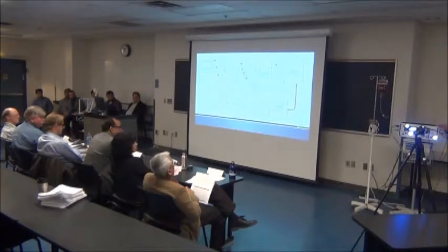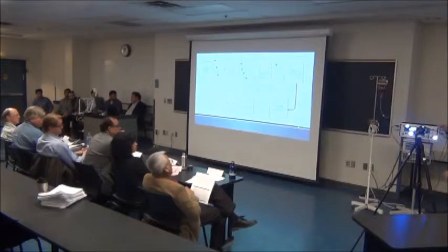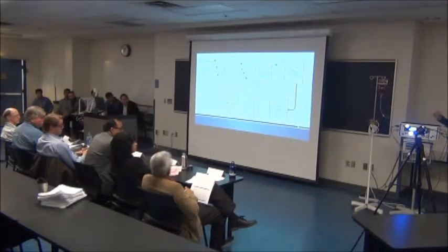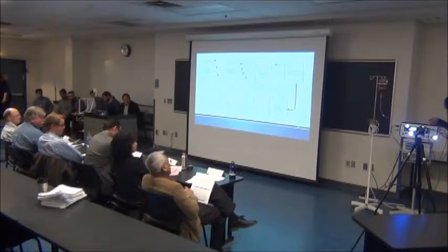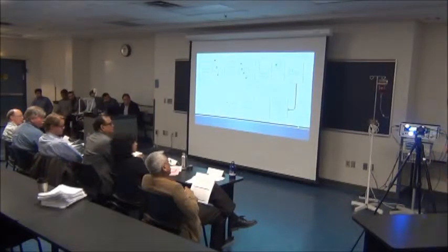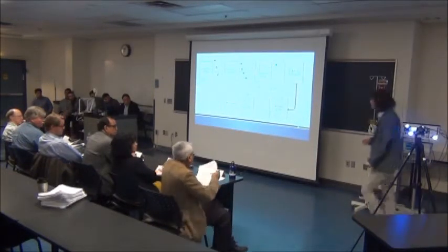As we can see, this section over here is the 5 different modes, and we have this push button. This push button will recycle the counter. The first stage, as we can see, is the blood pressure monitor, which we can see on the screen. The second one is 0, which we use as the 0 line for our circuit. We also have the 100, 150, and 200 millimeters of mercury for the calibration signal.